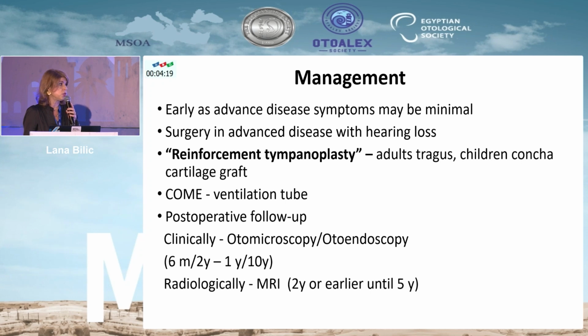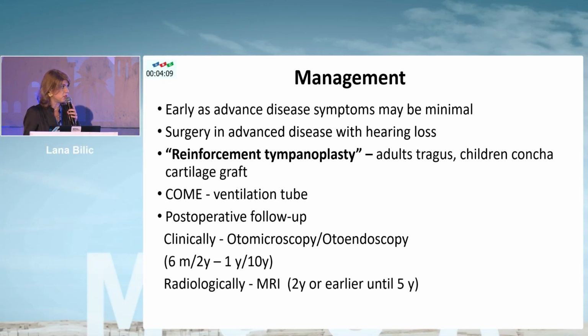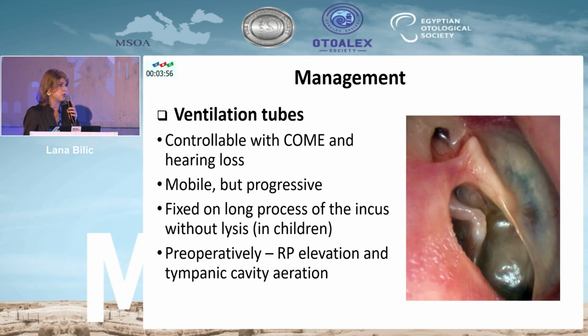There is also a question if we have chronic otitis media with effusion: we'll put a ventilation tube. Post-operatively we follow up clinically, of course, every 6 months until 2 years after the surgery, or once a year until 10 years after the surgery. Radiologically, we'll perform MRI 2 years after the surgery, or even earlier, until 5 years after the surgery.